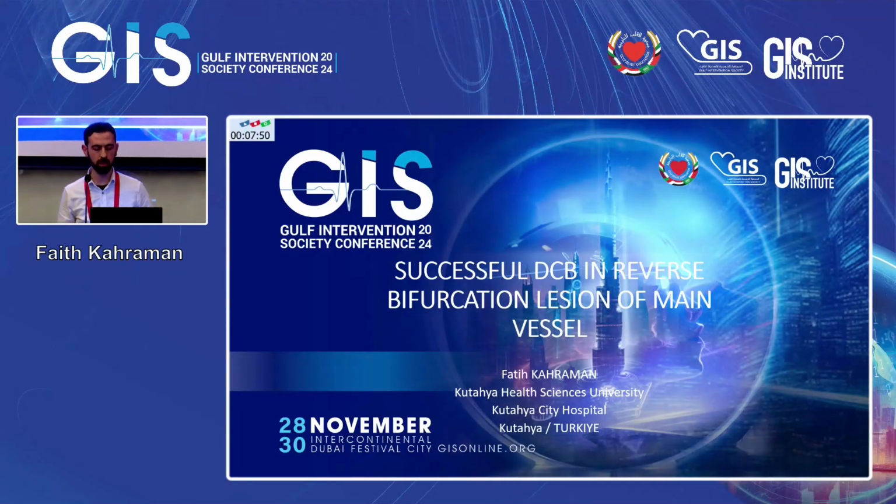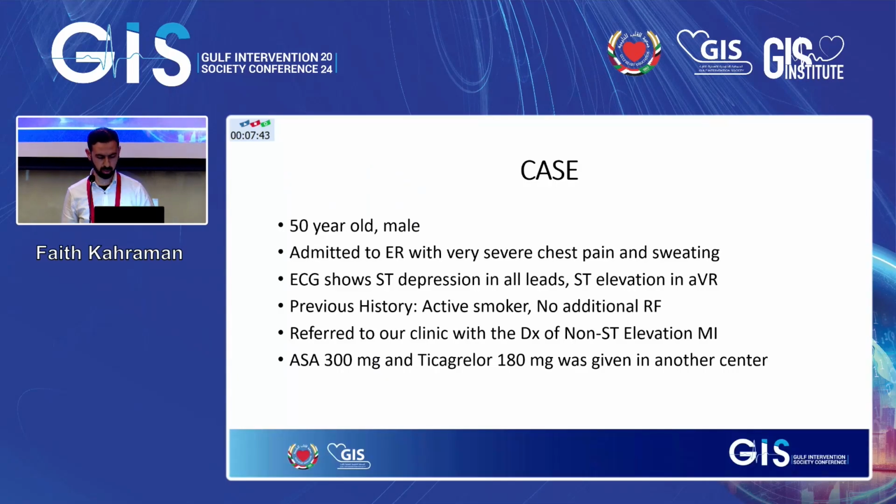I will try to share our DCB case with you. Our title is Successful DCB in Reverse Bifurcation Lesion of Main Vessel. Our patient was very similar to the previous case.